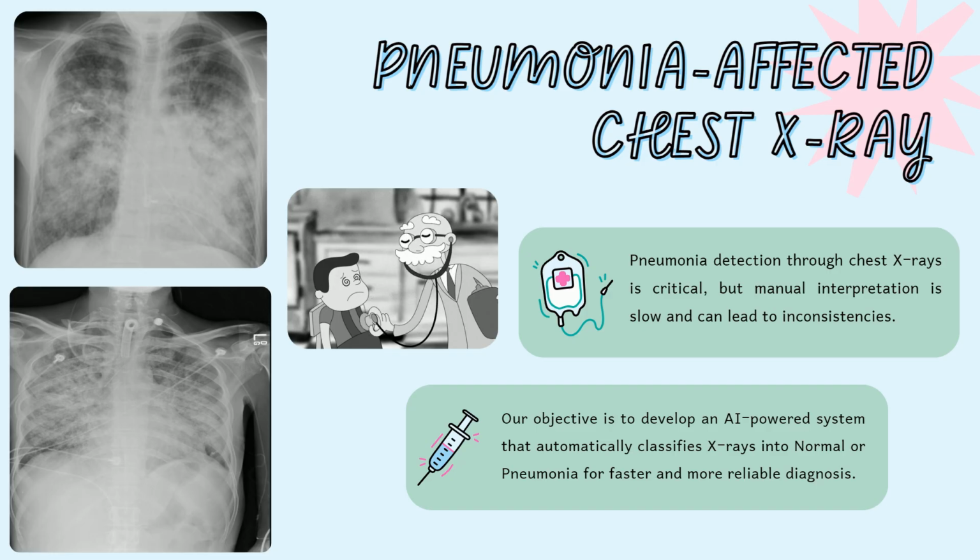To the untrained eye, these differences might seem obvious, but for an AI model, detecting these subtle patterns consistently across thousands of images is actually quite challenging. That is the problem we are solving. Teaching machines to see what doctors see, and in some cases, even help them see better.